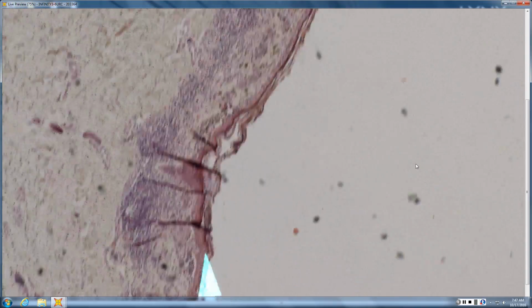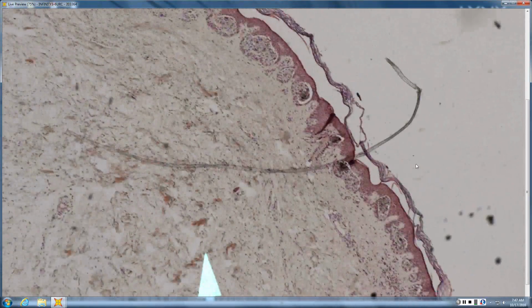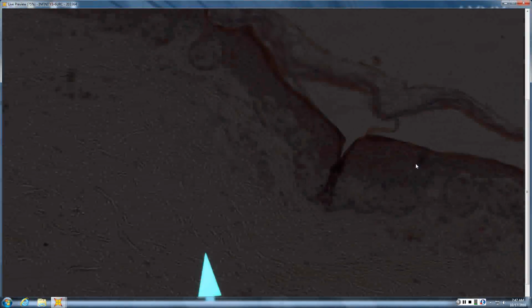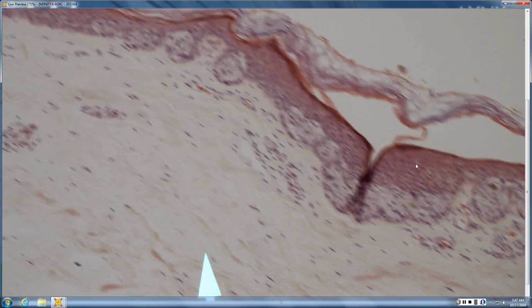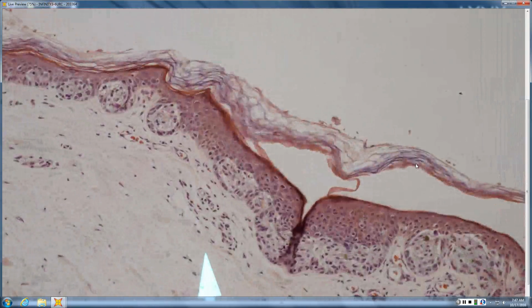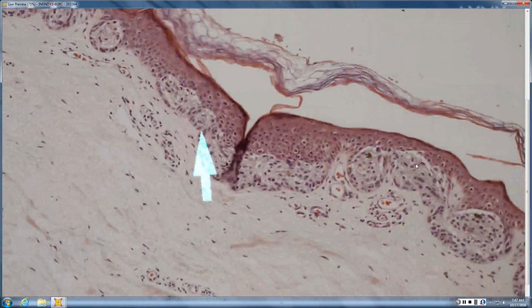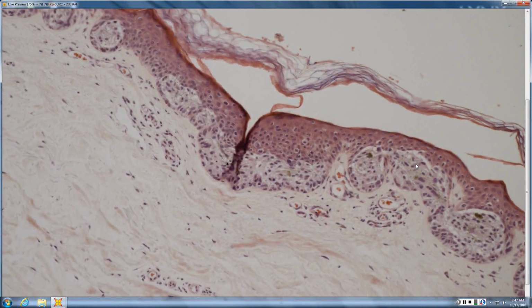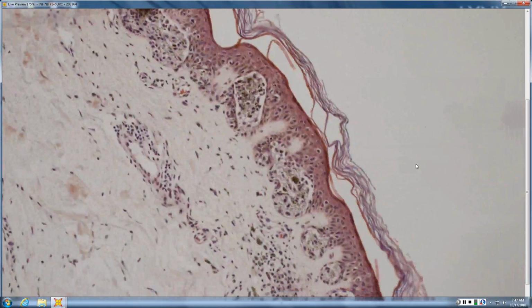Okay, Rachel, what do you think? Okay, so I've got a broad lesion. It looks like there's some sort of nest maybe. So broad lesion, junctional nests. Are the nests similar in size and shape to one another? There's some variation. Are they equidistant from one another? No. And areas where there are bizarre sausage-shaped junctional nests? I'm going to go with yes. If you say so.